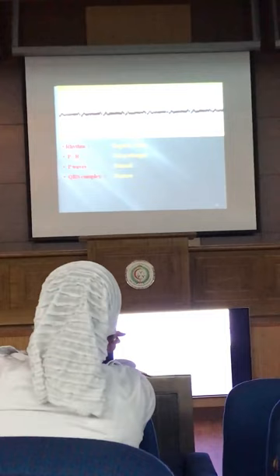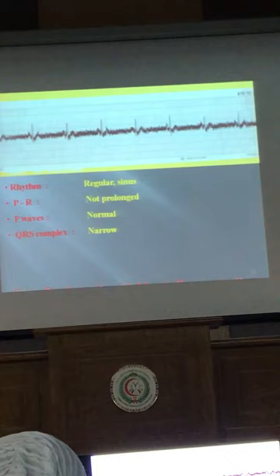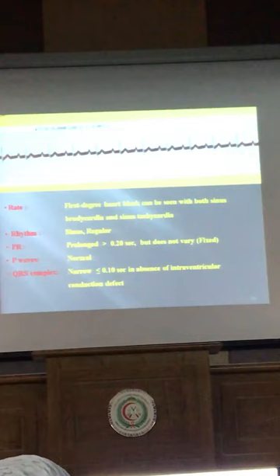What is this? There are sinus problems — sinus bradycardia. The rate is around 1, 2, 3, 4, 5, 6, 7 — maybe 40 beats per minute. And there are muscle tremors. So this is sinus bradycardia with muscle tremors.